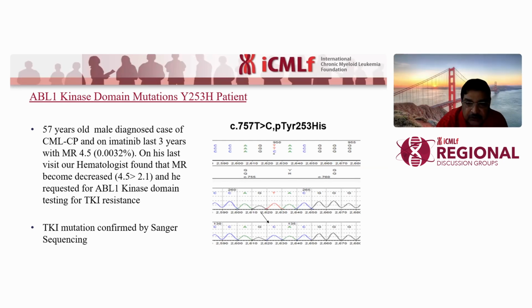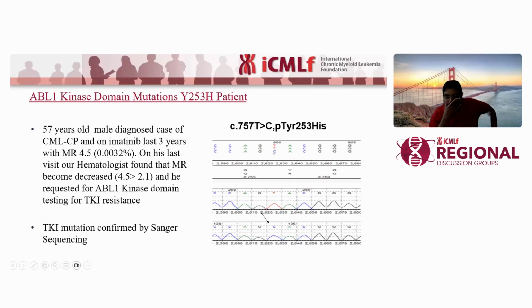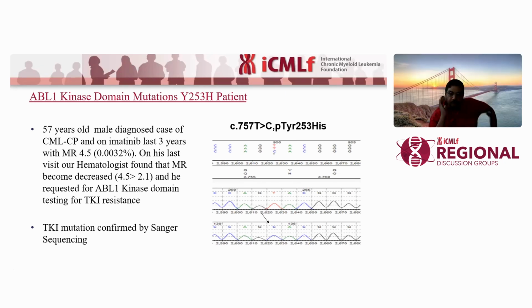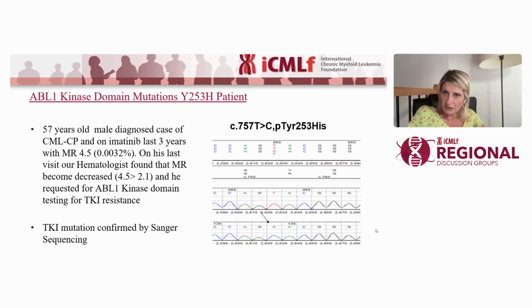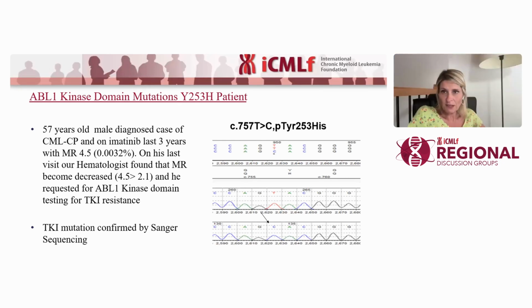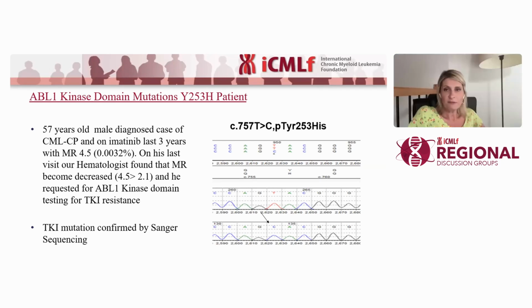I think the detection of compound mutations is better in NGS because you detect compound mutations. Yes, that's true, but you know what? You can pick up the majority of compound mutations only if you're running at least 500 cycles, which takes time and cannot always be done. I heard of a lot of laboratories that are producing shorter reads to have quicker runs, for example on the MiSeq, but in this case, you will miss a lot of compound mutation detection.